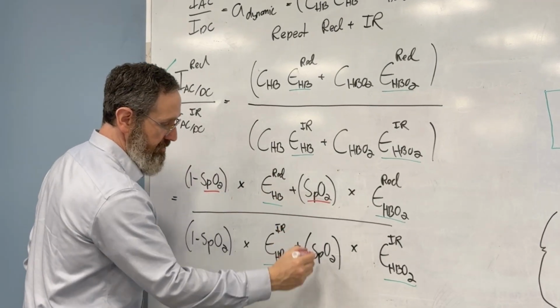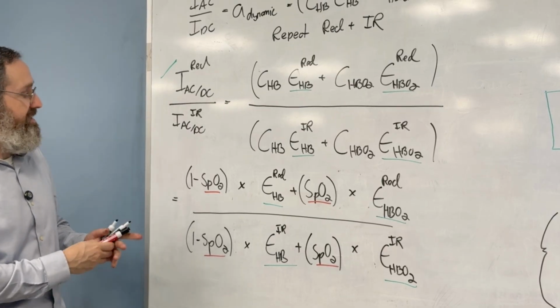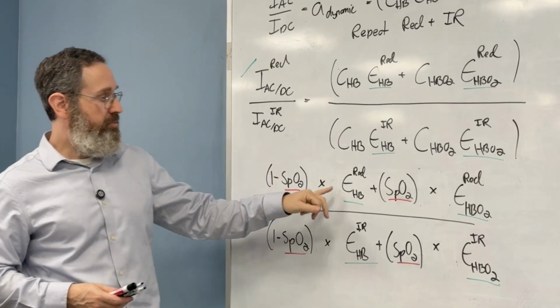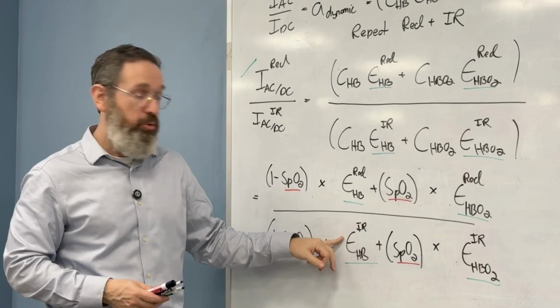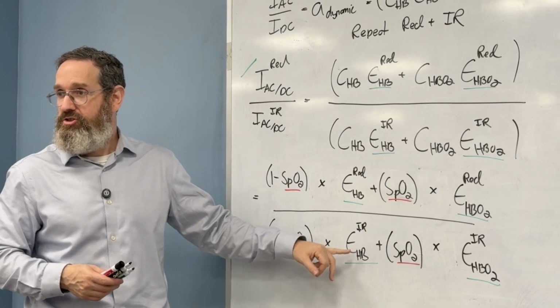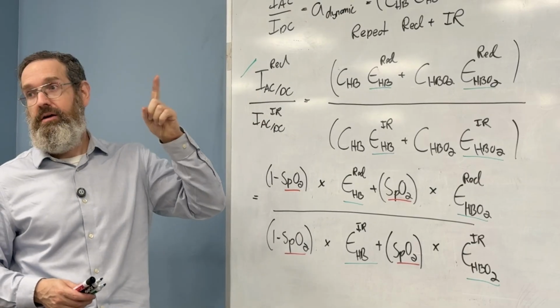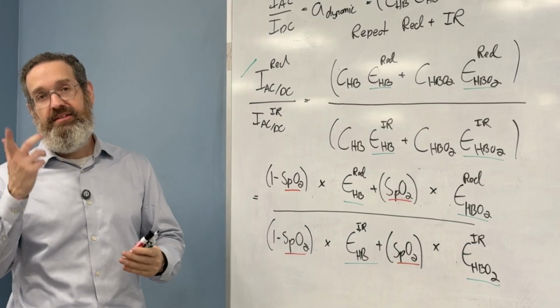Unknown, unknown, unknown, unknown. So to be clear, this is a number, 1.5. And this is a number 3, and this is a number 6, and this is a number 2, and this is a number 0.1. Don't worry about the complicated notation, right? So if I were to give you this, how many equations? Still 1. How many unknowns? 1. And that's how the pulse oximeter works.